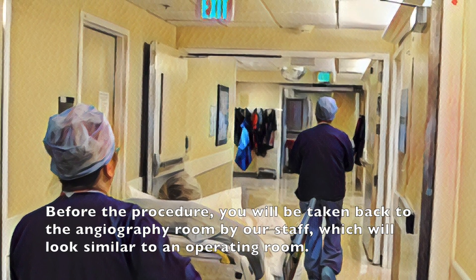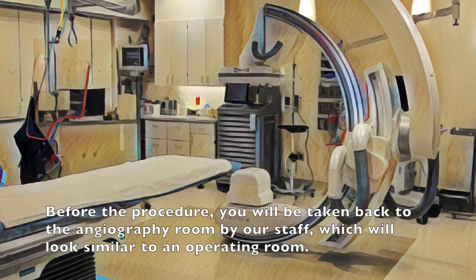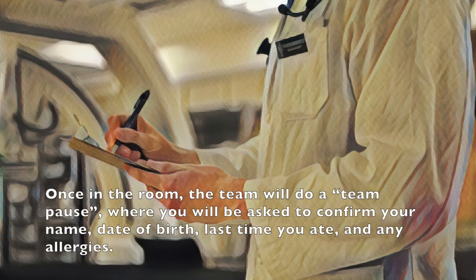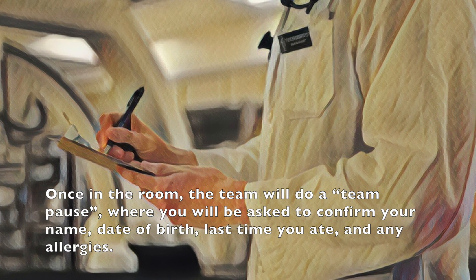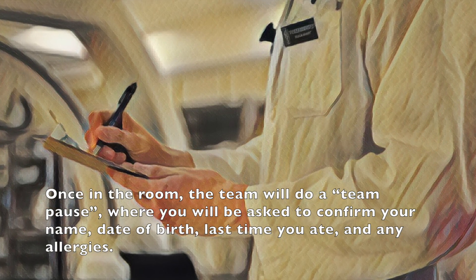Before the procedure you will be taken back to the angiography room by our staff, which will look similar to an operating room. Once in the room the team will do a team pause, where you will be asked to confirm your name, date of birth, last time you ate, and any allergies.